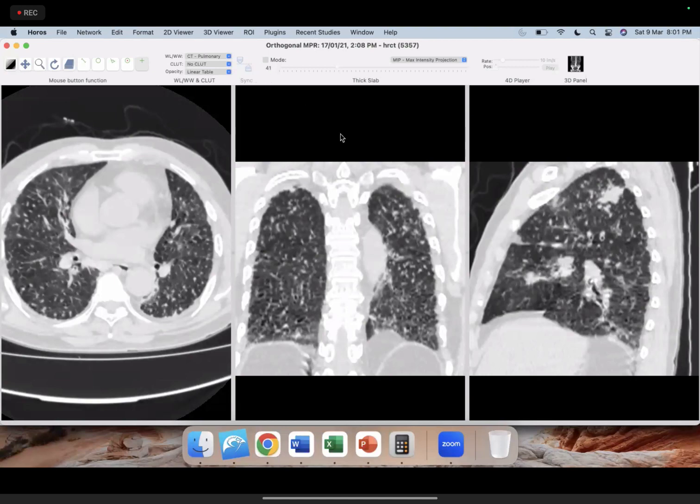So earlier we used to say something like an aging lung, which is many a time seen in elderly patients who do not have any clinical history or suspicion for ILD, but you see those reticular opacities. Then what do you call it? Do you call it an interstitial abnormality? And those are still to be followed up. So even if you label ILA, you have to ask for follow-up after 1 to 2 years whenever there is a clinical need, because if there is progression, they can also change to a frank ILD. So that's why label ILA and then ask for follow-up.